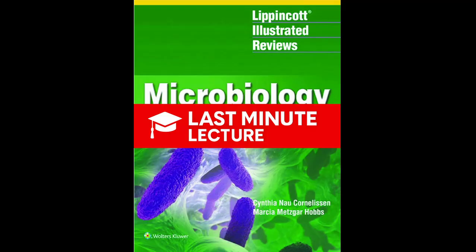And the main tool for this is the ELISA test. The book calls it a sandwich. A molecular sandwich, yeah. You have an antibody stuck to a plate. It grabs the bug's antigen from the patient's blood. Then you add a second antibody that also sticks to the antigen, and that second one has an enzyme attached to it. So the antigen is the meat in the middle.